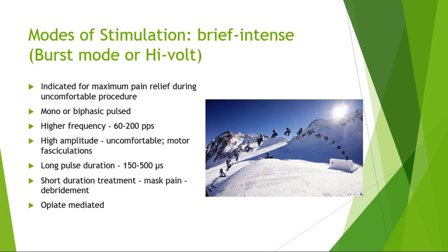So burst mode or high volt, not as commonly used, but it's usually indicated for maximum pain relief during an uncomfortable procedure. Maybe you are doing some joint mobilization or overpressure on someone to get their range of motion after surgery. It's mono or biphasic pulsed, higher frequencies, higher pulse duration. It's high amplitude, uncomfortable. We're looking for motor fasciculations. So we're actually stimulating those motor nerves. It's a short duration treatment to mask pain, maybe during something like debridement, and it's opiate mediated.